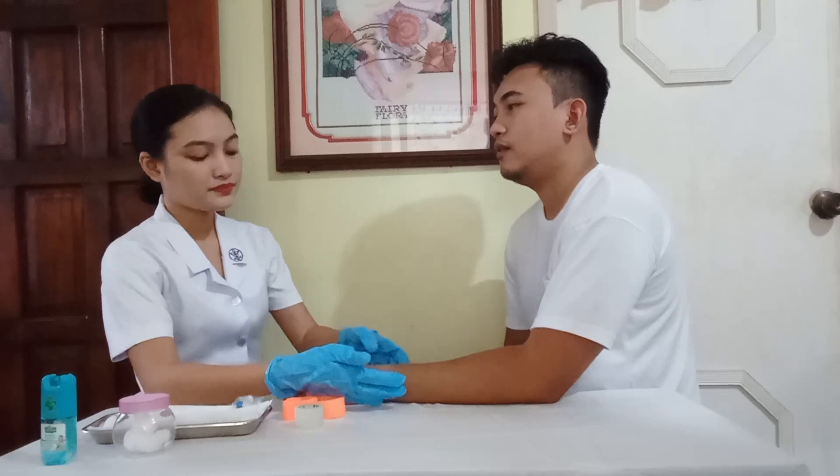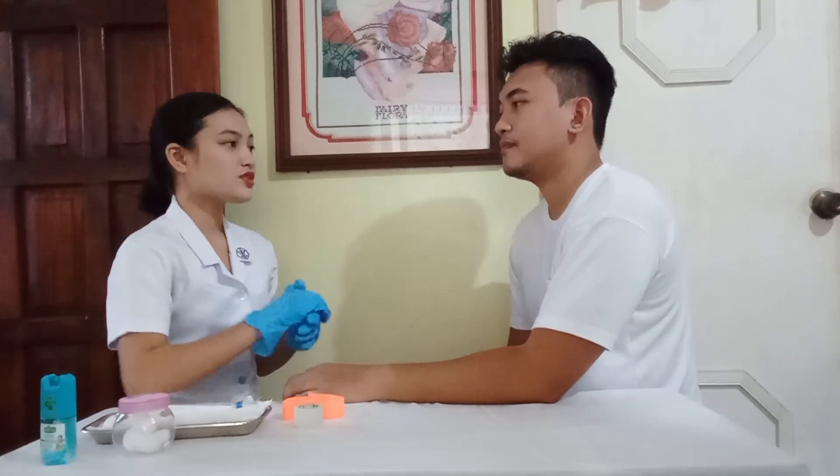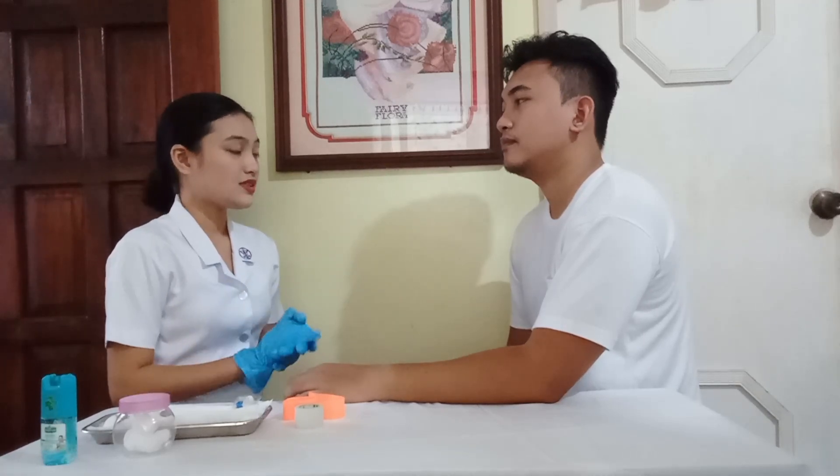Good morning, sir. I am Shikaina Aquino Maranga, your student nurse. Can you please tell me your name and birthday? Wanda Lacrimus, July 35, 1996. Okay. So sir, today we have to start you with an IV line as ordered by your doctor. This is done so that it is much more convenient for you and for your doctor to administer your medications and fluids.